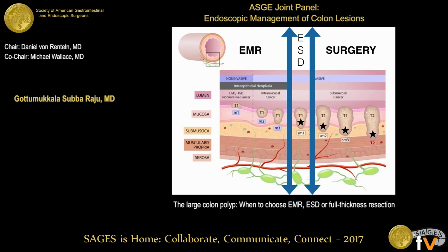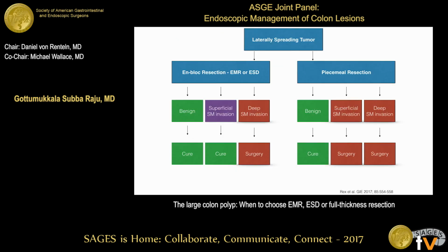The reason that is important is when you start ESD practice, there is a high incidence of perforation, between 5%, sometimes 10%, and whether it's worth putting these patients through complicated procedures versus you can safely do a large EMR, and those small percentage of patients that have cancer could go for surgery. So something to keep in mind.